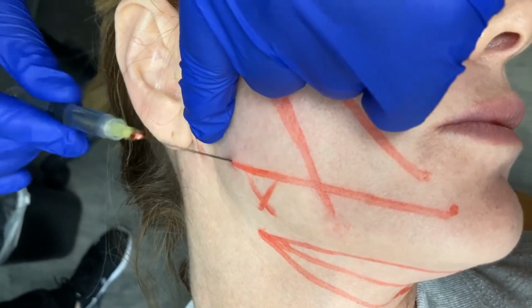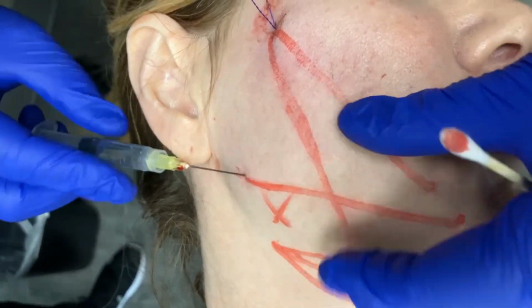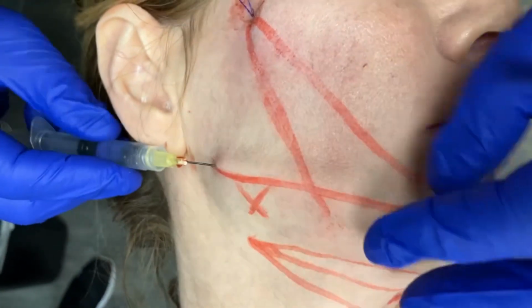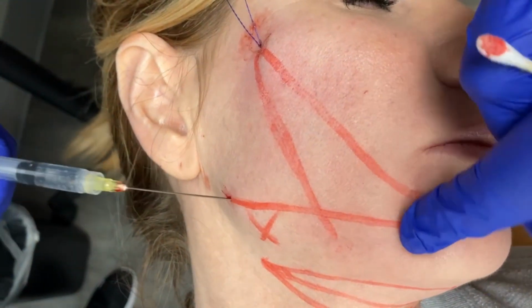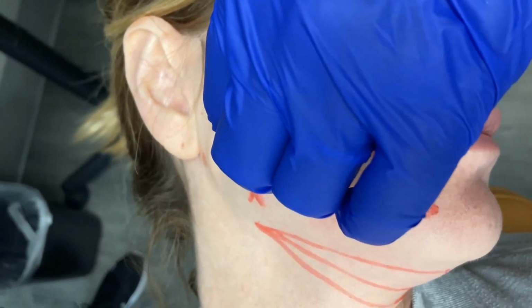Now, ComfortDocs microcannula, going to pre-tunnel this. As you can see, we'll use one. That's all we're going to use in this case. We're just going to pre-tunnel this and give some lidocaine on the way out so the patient is nice and comfortable here, and you can see she's even comfortable with that. And why ComfortDocs microcannula?